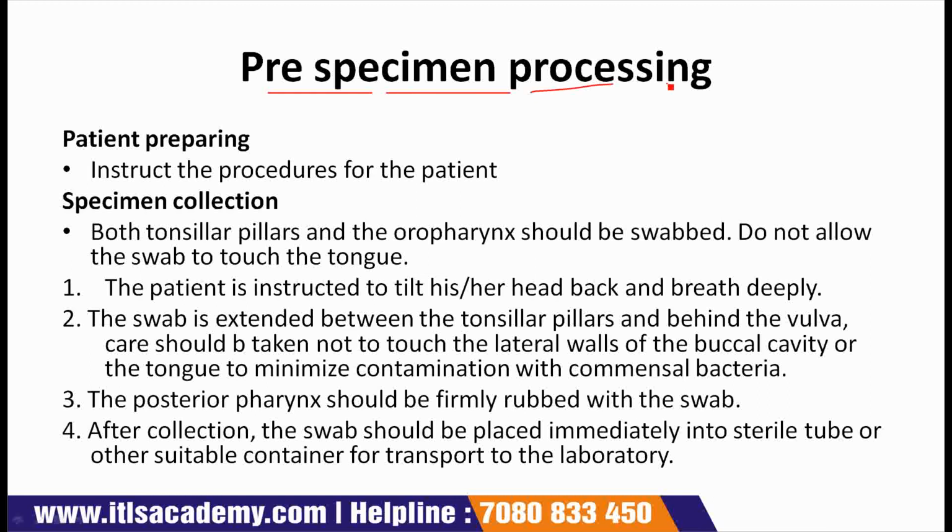Pre-specimen processing. First is patient preparation.